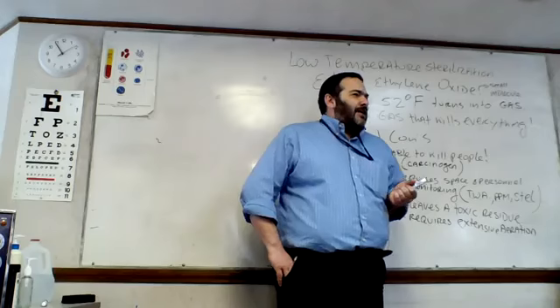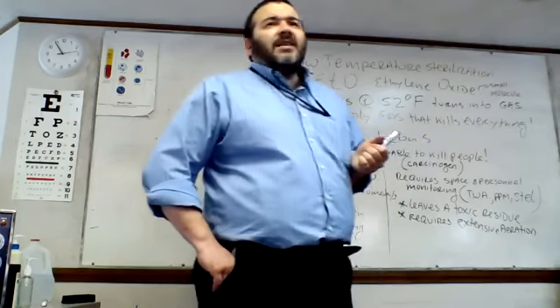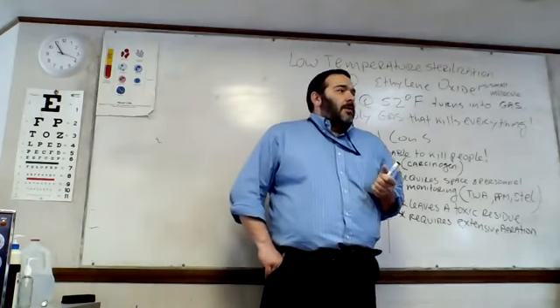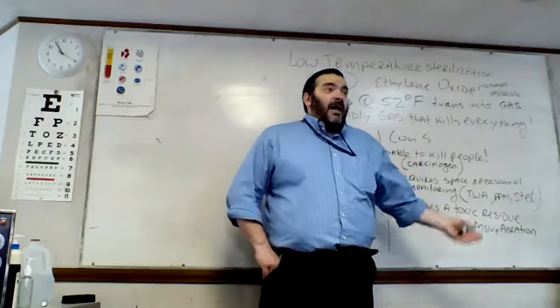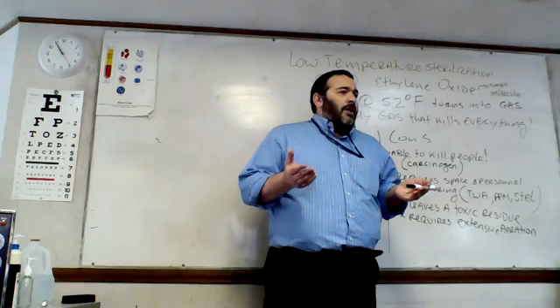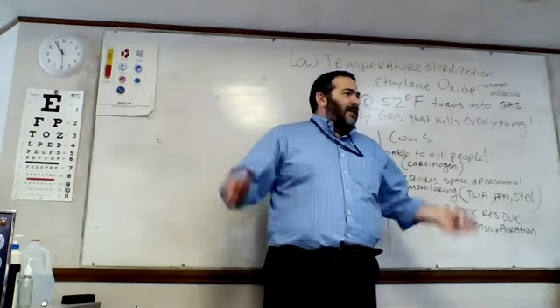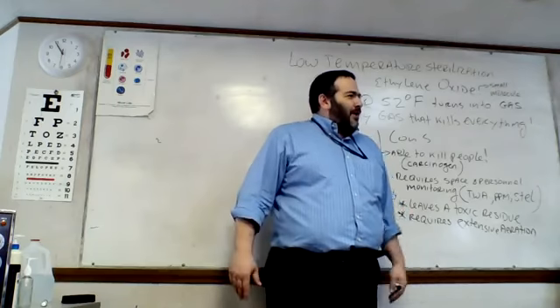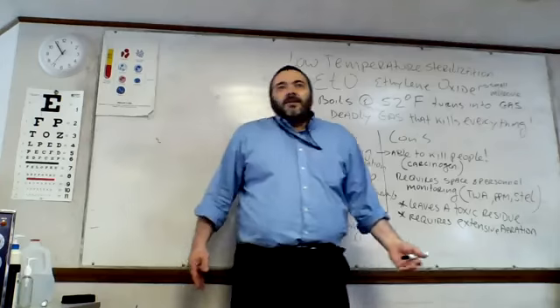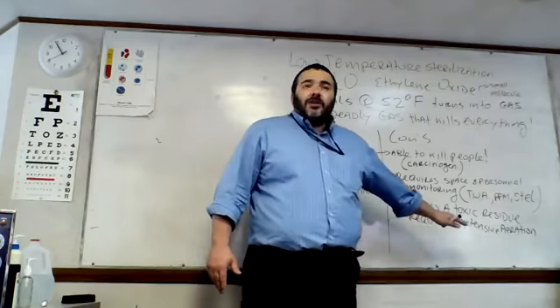What does the dry cycle involve for regular laundry? How does the dryer work? Huh? Blows hot air through your clothes. So what does hot air do? It turns the leftover water on your clothing into steam and then blows it out. That's why the exhaust is always wet, unless the clothes are already dry. Then it's dry. Right? Yes. Well, guess what? This is exactly, to a T, the process of aeration.